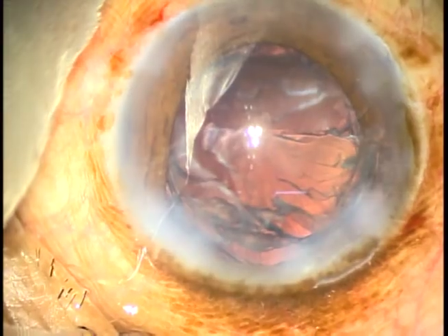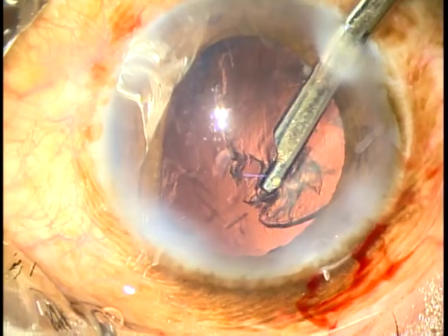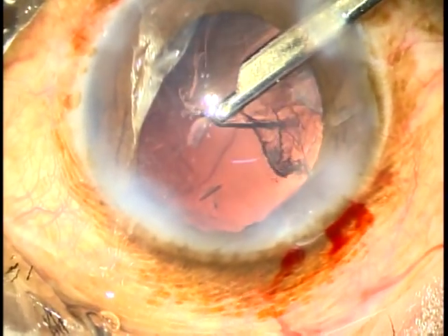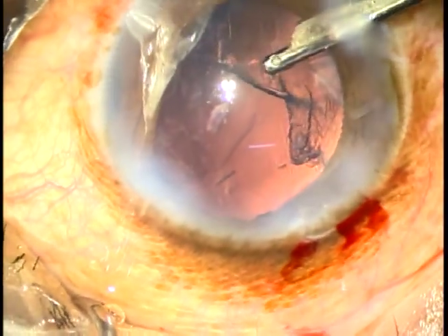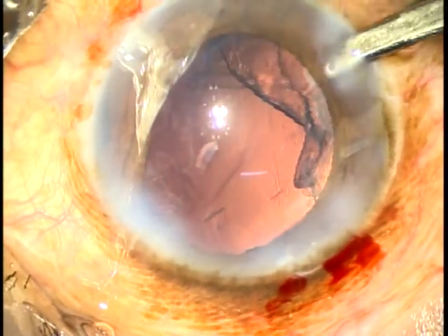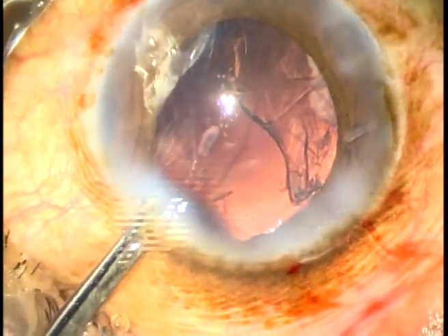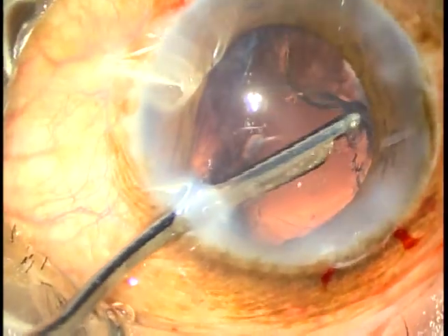I know that I have to manage the epinucleus by other means — either I have to enlarge the main incision, or if it comes out by the Simcoe cannula, that is very good. In this case, it was possible to remove the epinucleus gradually, slowly, with a lot of patience using the Simcoe cannula.